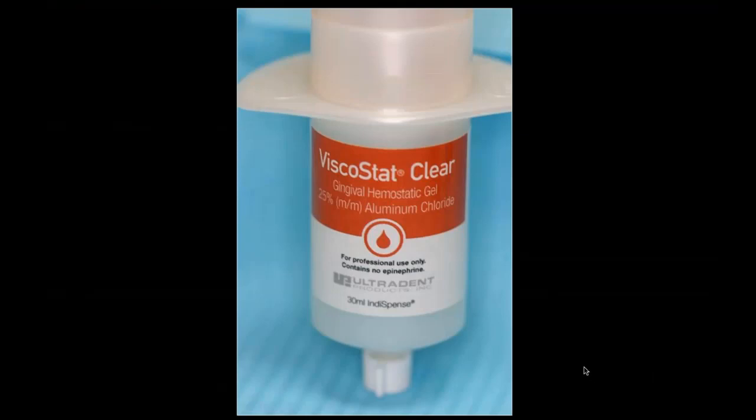A question: I see putty and wash on top of it at the same time for Invisalign impressions. Is this not correct? If it's working for you, great. Yes, I've actually done that with crown and bridge.